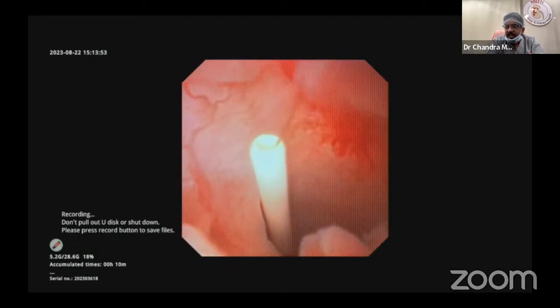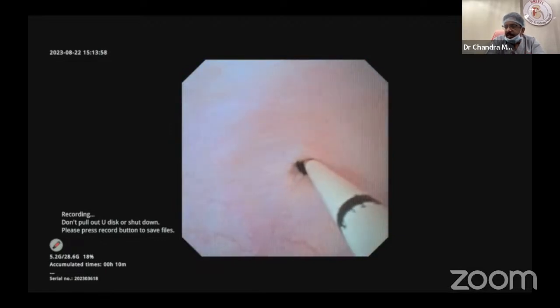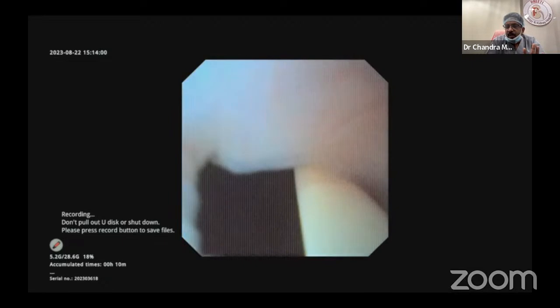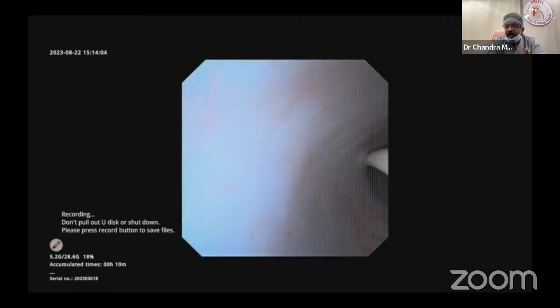See the ureteric catheter. See the ureter, the upper ureter. Nothing great. By doing it repeatedly, you will not get any problem. See how easily the 13.5 is going. But a rigid scope does not go because it will have torque. Bleeding can occur. In this case, bleeding will never happen.